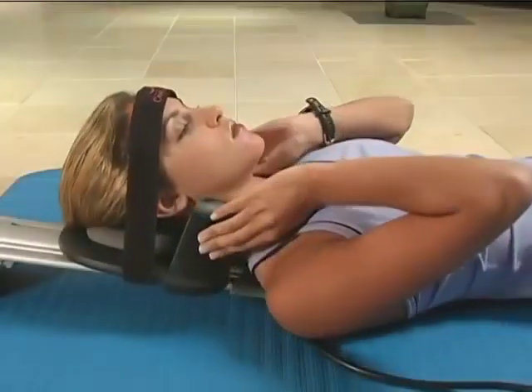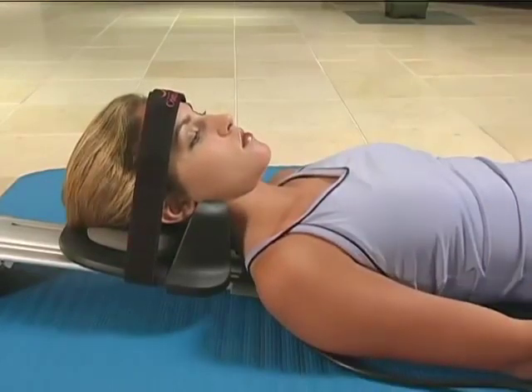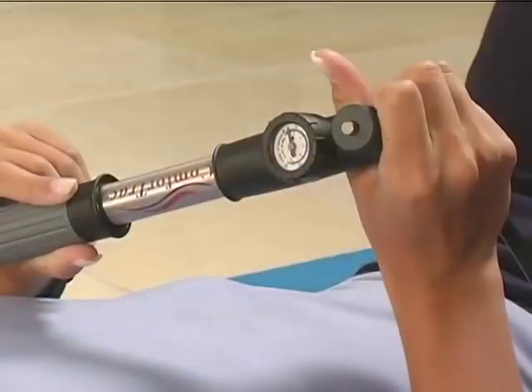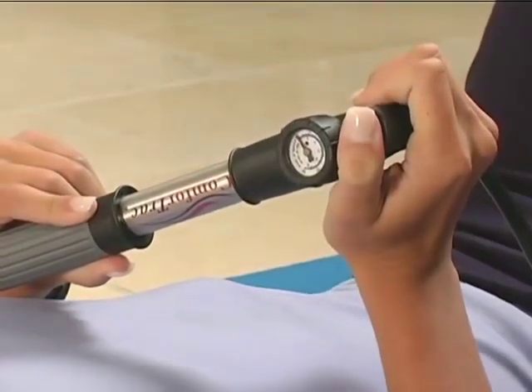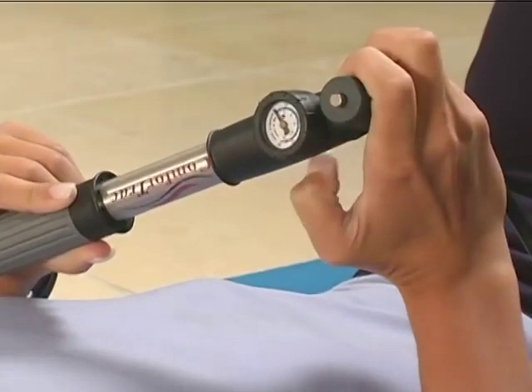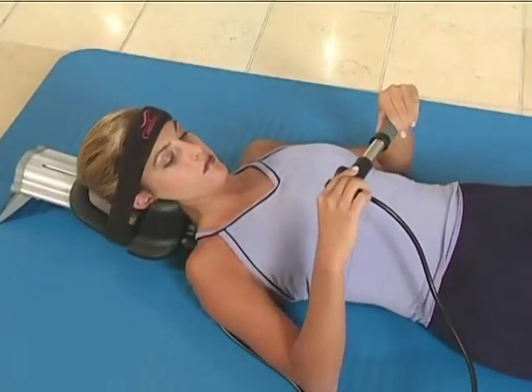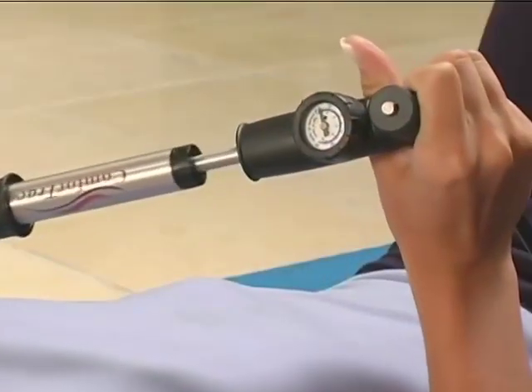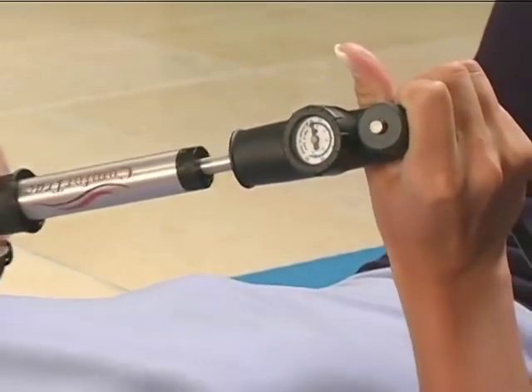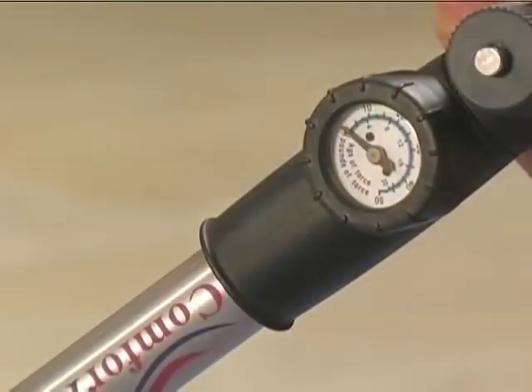Slide your body down so that the neck wedges are making firm contact with the back of your head. Once again, ensure that the head slide is in the starting position by pressing and holding the air release button. Now you are ready to begin gradually pumping air into the device. Monitor the hand pump gauge and stop pumping when the recommended amount of traction force has been attained. The hand pump will hold the pressure automatically.